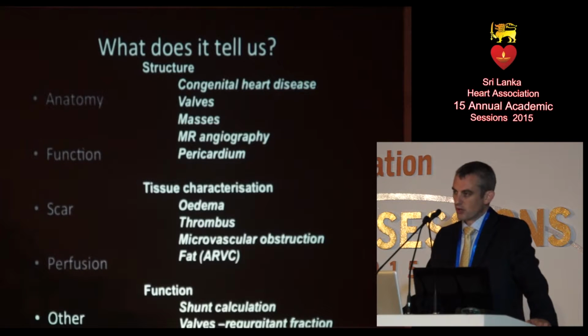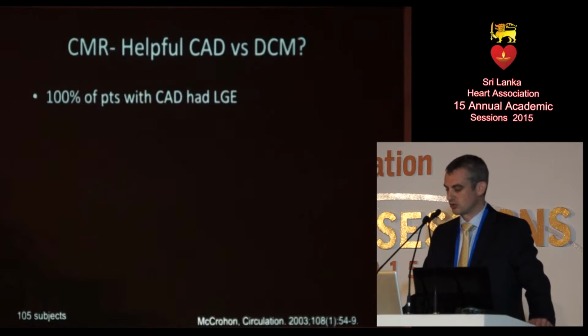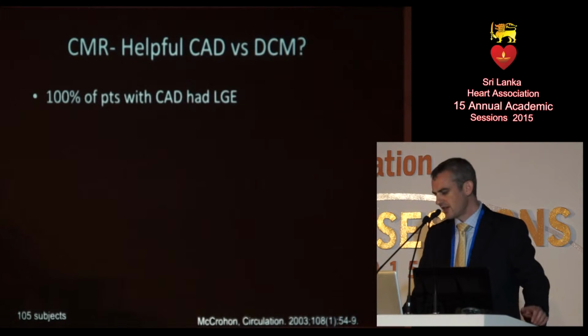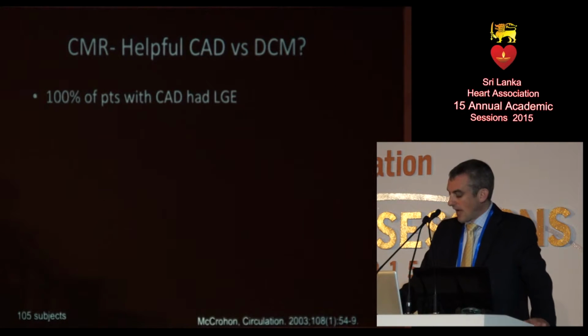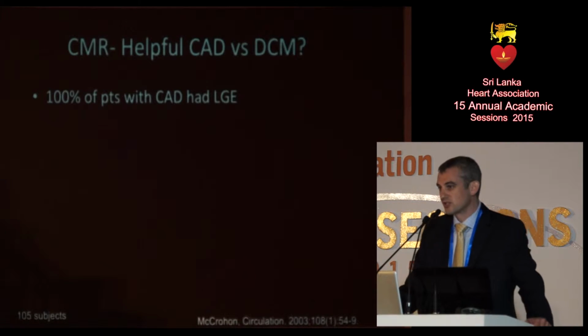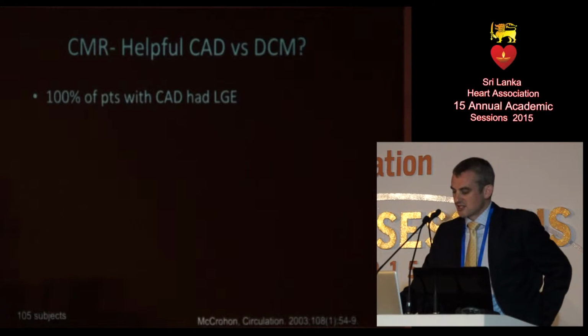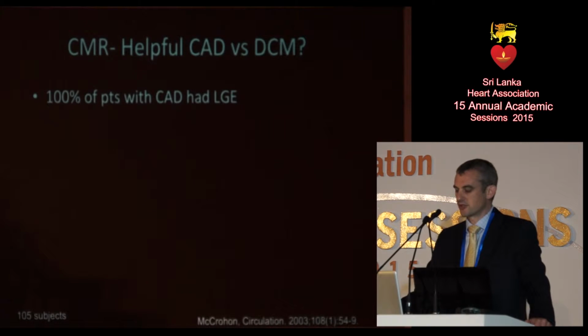So there's also an awful lot of other information we can get from cardiac MRI imaging in heart failure, as listed there, and I won't go through that in huge amounts of detail. So, as I said, we're frequently now using MRI instead of angiography to delineate the etiology of heart failure, which is important because it will influence our management. Are we justified in doing that? Well, there's increasing data really supporting that as a strategy.